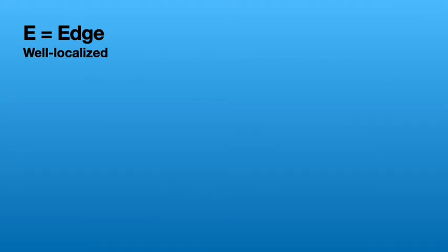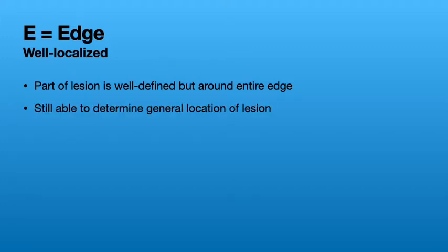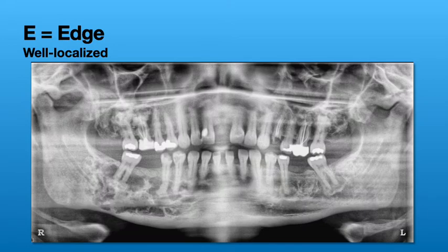The third category falls in between well-defined and ill-defined, because not everything fits neatly into either category. It is called well-localized. A well-localized lesion is one where part of the lesion is well-defined, but you can't trace the entire edge around it — you can still generally determine the overall location of the lesion. On this panoramic radiograph, I would classify this as well-localized, as we can tell it's in the tooth-bearing regions of the maxilla and mandible, but can't clearly trace the outline everywhere.